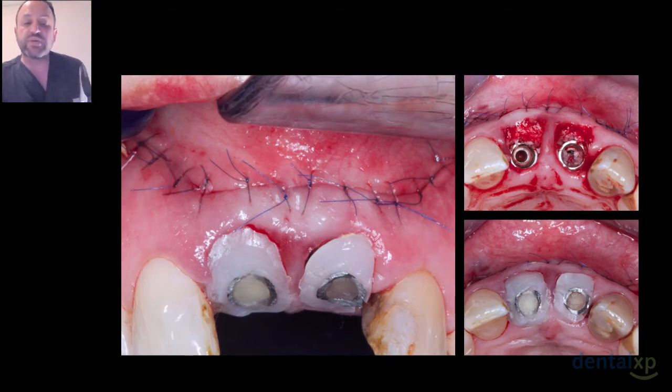The reason we customize the abutments is it helps to support the buccal soft tissue and prevent the collapse of the buccal soft tissue, so that we don't end up with a situation where we've placed normal healing abutments, the soft tissue's collapsed over, and we still end up losing 0.5 millimeter of our gingiva. So this way we support it. We do dual zone therapy by packing the bone as high as possible as well to support the soft tissue, a la Stephen Chu and Dennis Tarnow.